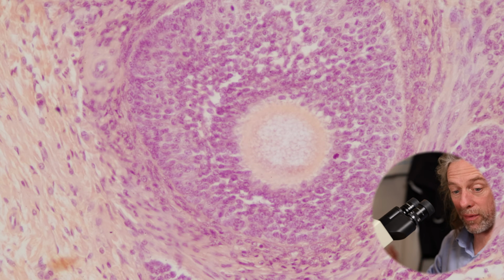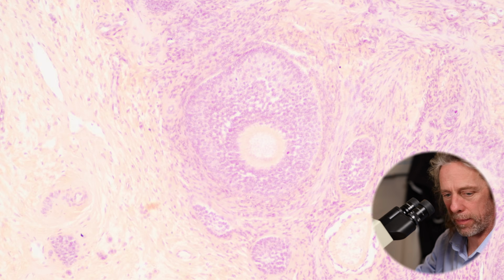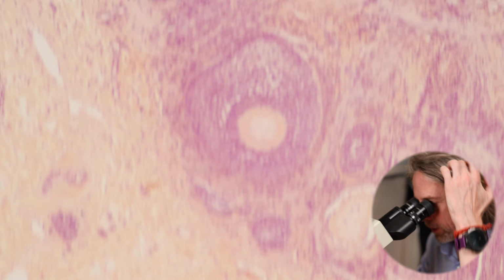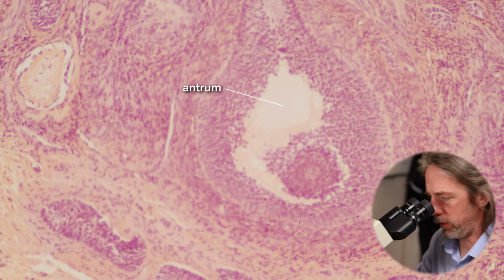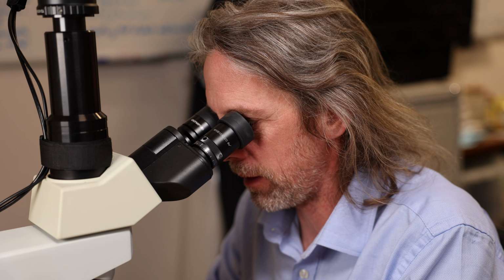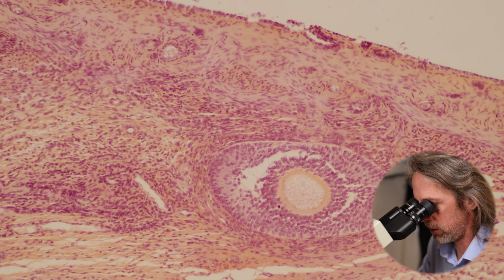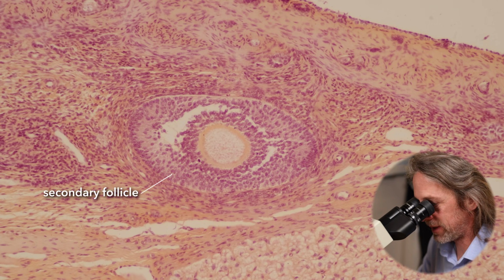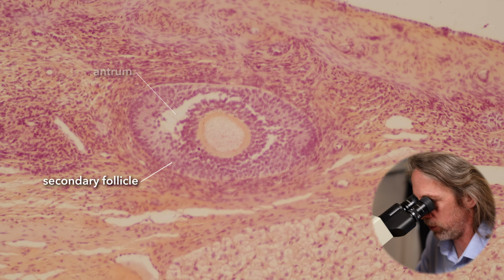Now, let's see if we can find the next stage, where that fluid-filled cavity becomes a single cavity. So that's what we're seeing there. But I don't think that's a very nice shape. That's just the plane of section that has caused that. And then as it pulls more fluid into it, it starts to look, oh, there we go, like that. That looks like an eye, doesn't it? So we're starting to see spaces forming in there. Those spaces are supposed to be in there. That's part of the development of a secondary follicle.